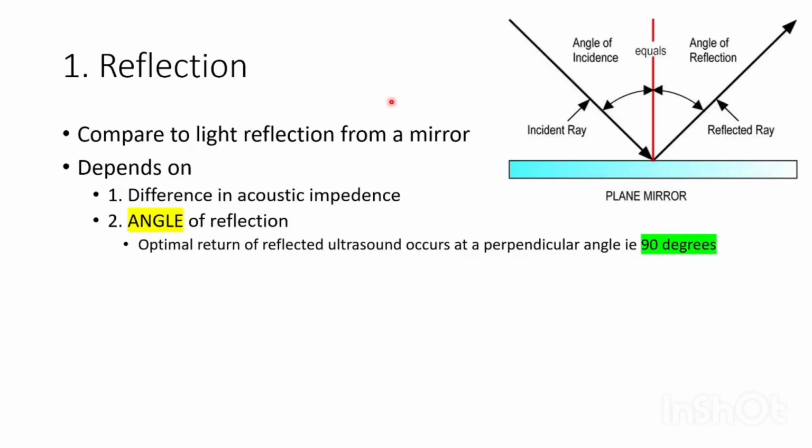So first is the reflection. Compare the ultrasound beam reflection to a light reflection which we have studied in physics in our plus 2 and all.